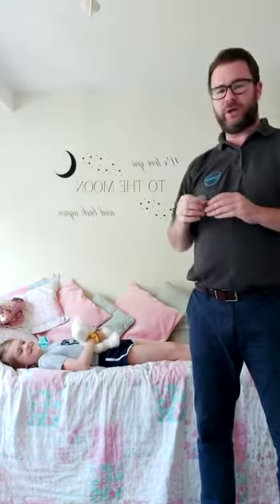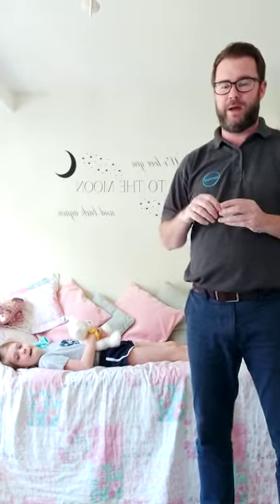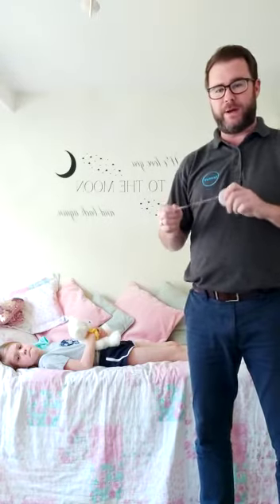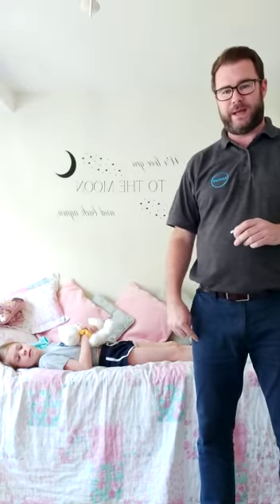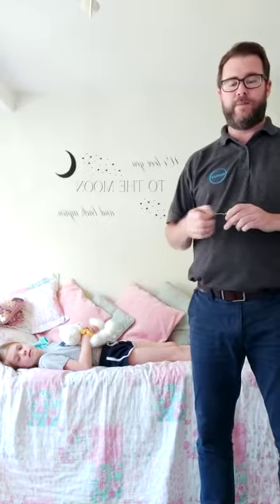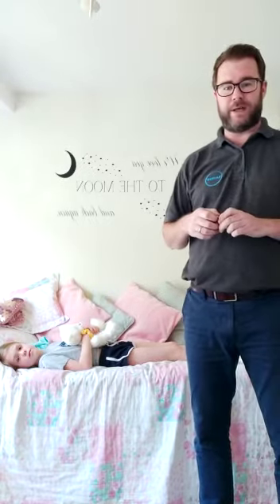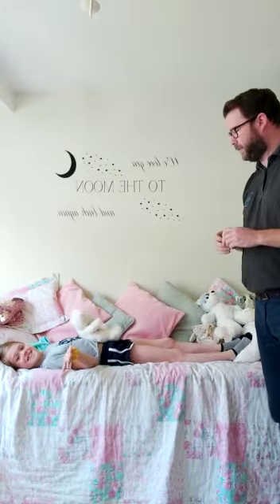Hope you're all feeling well and keeping safe. We're going to concentrate on the MyGo stander in a supine position — so laying on your back. We'll start with the measurements, which are the same as with the Horizon: heel to top of shoulder, heel to hip, and heel to knee. We'll show those again. This is for the MyGo stand-up, but you can also use these for the Horizon stand-up.